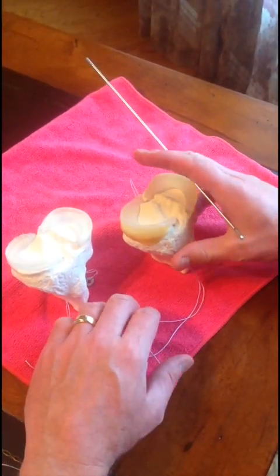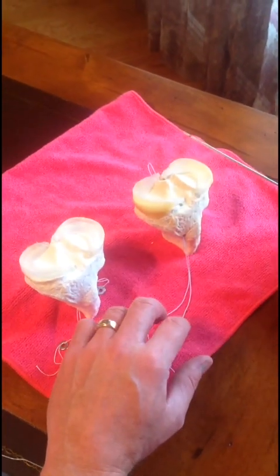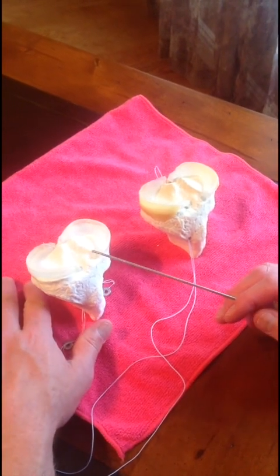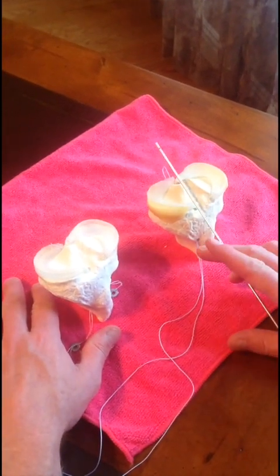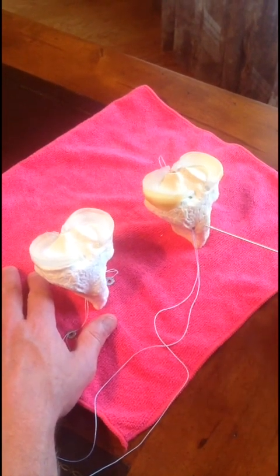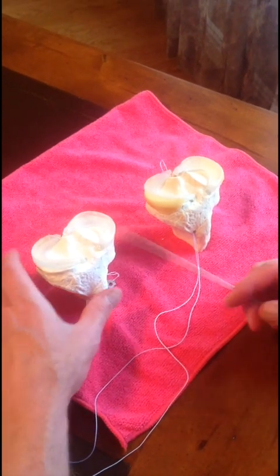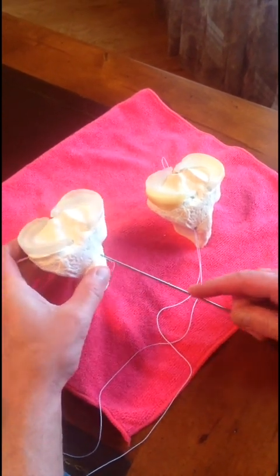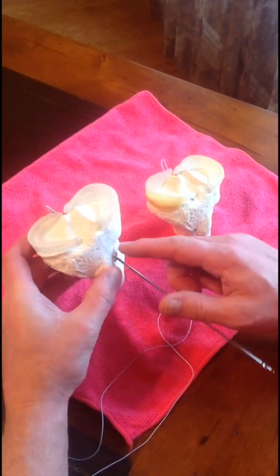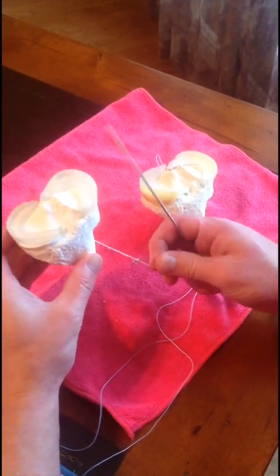I got asked a question about whether I would cross my tunnels, meaning go from medial aspect to lateral route and from lateral aspect to medial route as a way to ease tunnel placement and try to get it more anatomic. What I find is that in doing that you can crisscross your tunnels, and if you're doing a concomitant ACL or PCL then you might run into a problem with your graft. So instead, rather than crossing our tunnels as I'm showing here, I prefer to come more straight at it.